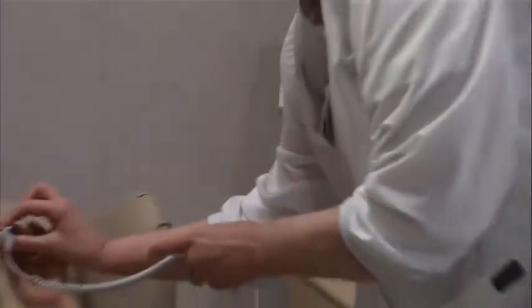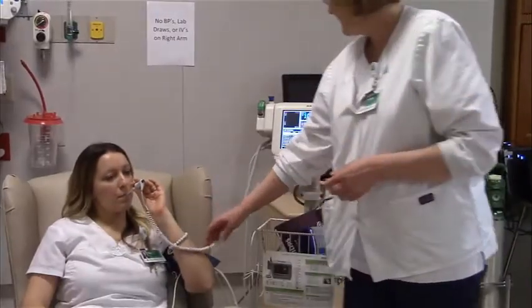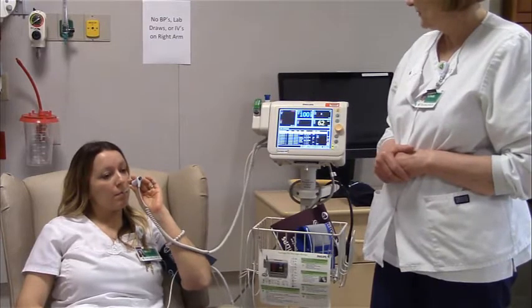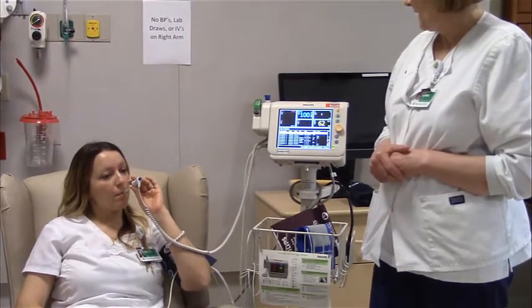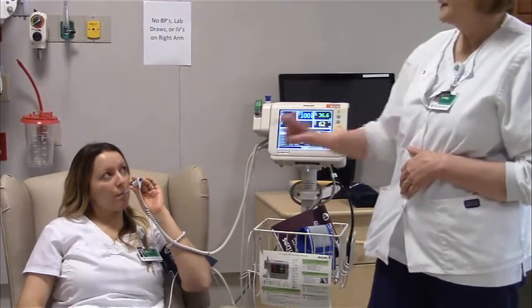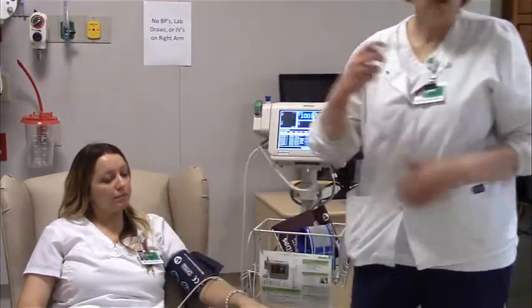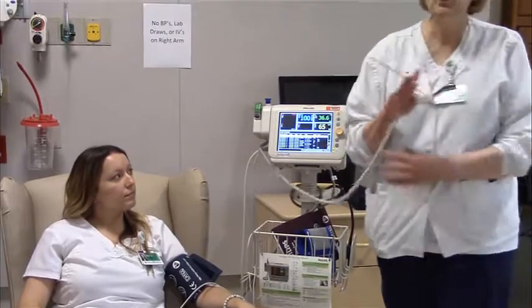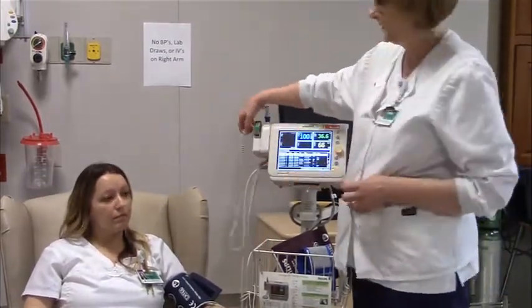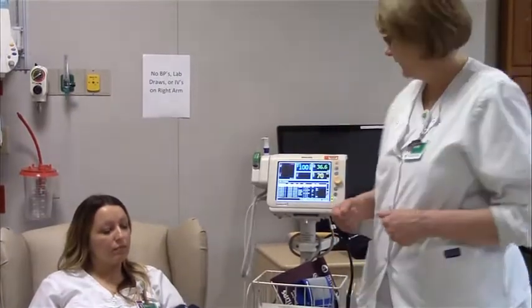Stacy's going to help me. And you want to put it at the base of the tongue. And again, while she's doing that, I can be counting the rise and fall of her chest. And it won't take that long. The machine gives me a 36.6. It's oral. I want to make sure that I shoot my thermometer probe cover off into the trash so that it does not become a slipping hazard if I accidentally lose it on the floor.